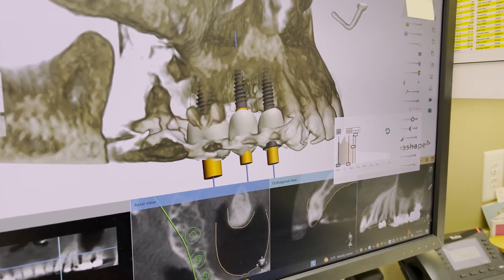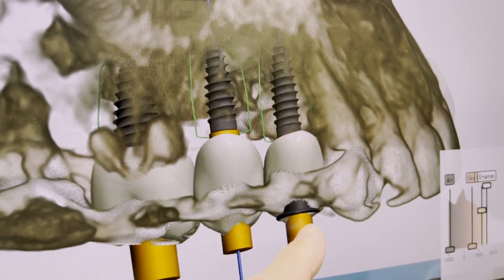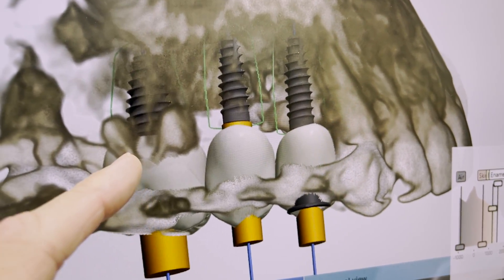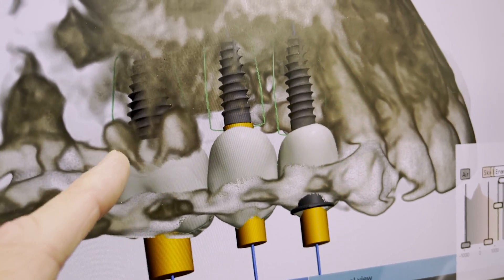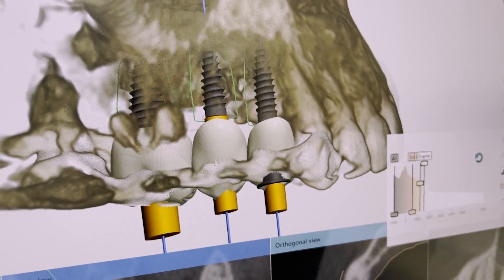The first thing we're going to do this morning is sit down and review the treatment plan. We've got three implants going in the upper right. These two are going into healed sites, and this one is going into a fresh extraction socket. We have a molar here that has some root blunting, so we feel pretty good about our five-thread rule. Let's go see how it actually plays out.